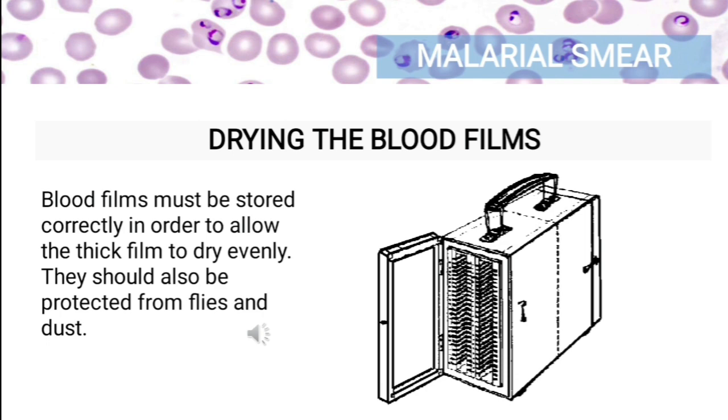In warm, humid climates, however, autofixation of unstained slides occurs quite rapidly and all slides should be stained as soon as possible, at the latest within 3 days of collection. When long storage is unavoidable, the slides can be kept in a desiccator to delay autofixation. Finally, ensure that the slides are packed correctly and that they are not put into strong sunlight or near a source of heat, for example, the exhaust pipe of a vehicle in the field.